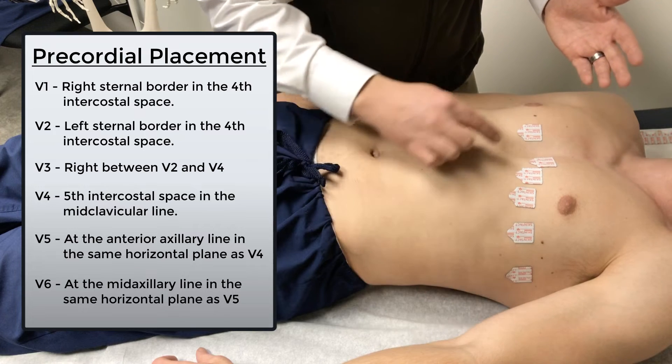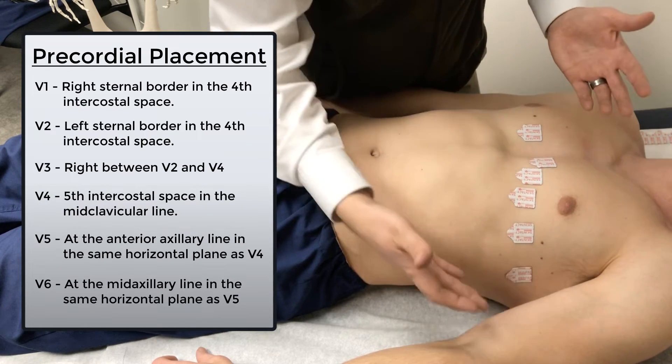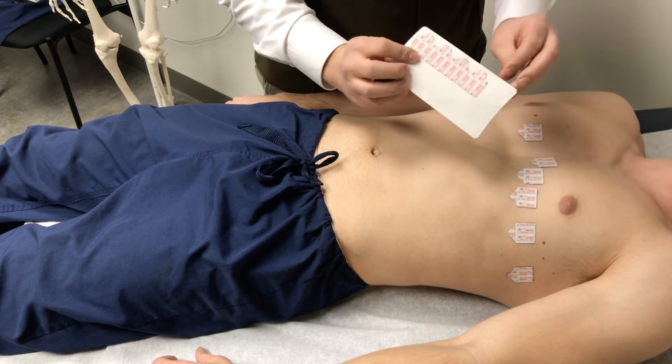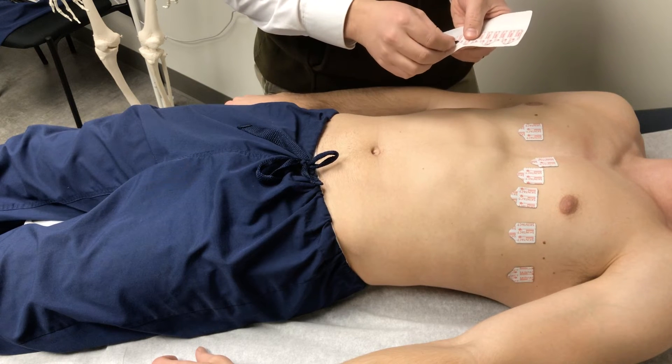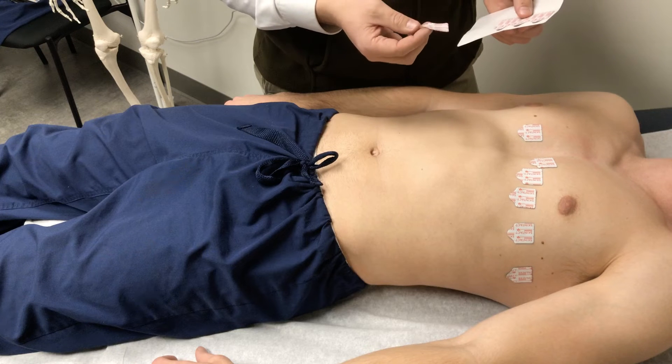So now we have our six precordial leads: V1, V2, V3, V4, V5, V6. Notice we've got four electrodes left over — these are our limb leads. We want to place two limb leads on the upper extremities and two limb leads on the lower extremities.